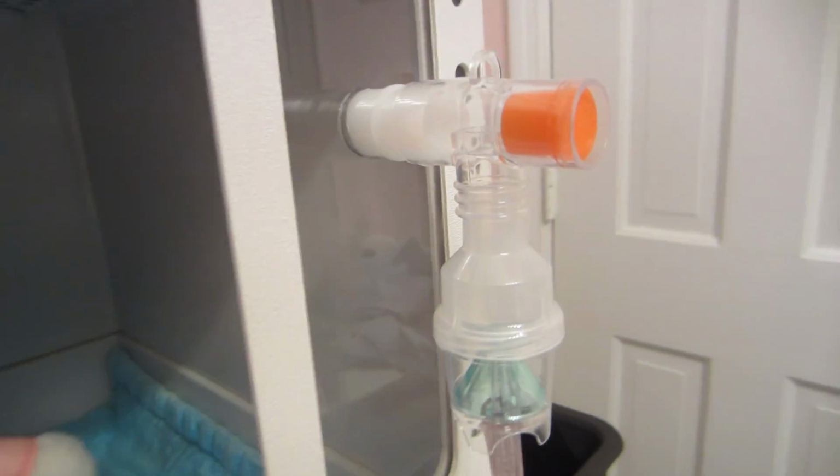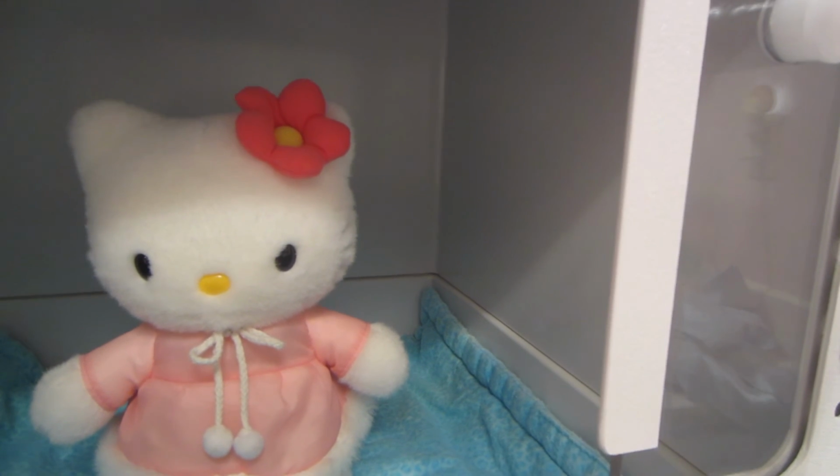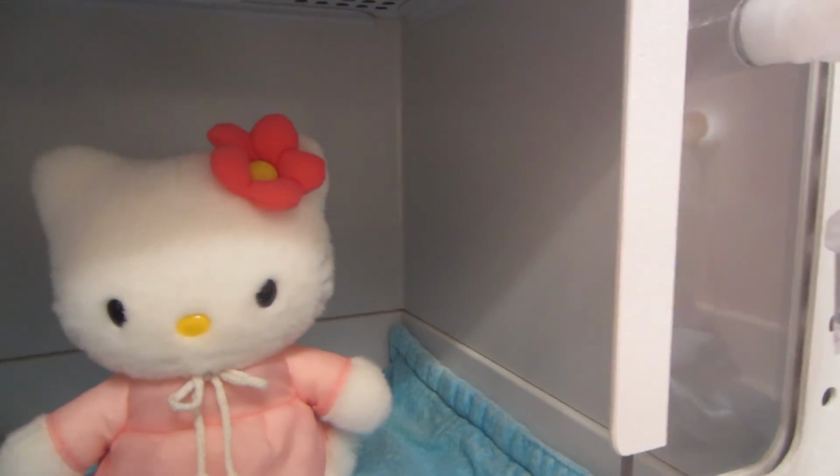But you just need to keep your kitty in there for about 30 minutes, or at least 30 minutes. It can be a few minutes longer. It's not going to hurt anything if it's in there for 32 or 34 minutes. And just keep an eye on things, and you should be fine.